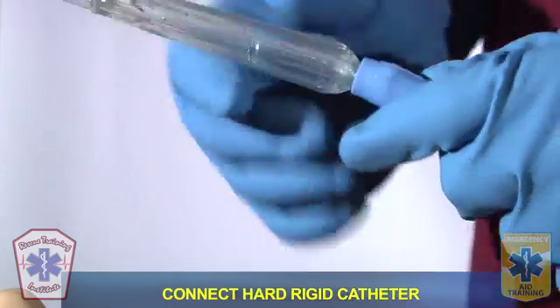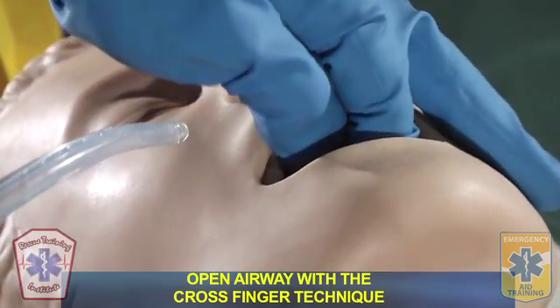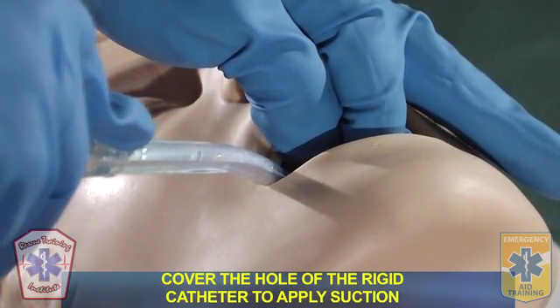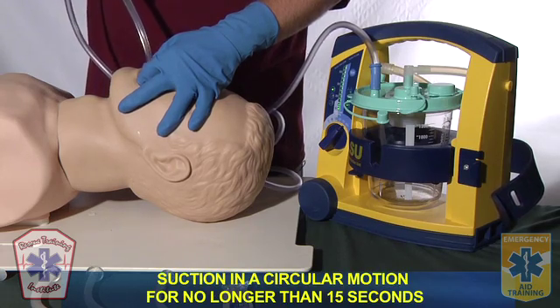I will now connect my rigid catheter. To open up the airway, I would do a cross-finger technique. I will insert my rigid catheter as far as I can see. To apply suction, I'll cover the hole, and I will suction no longer than 15 seconds.